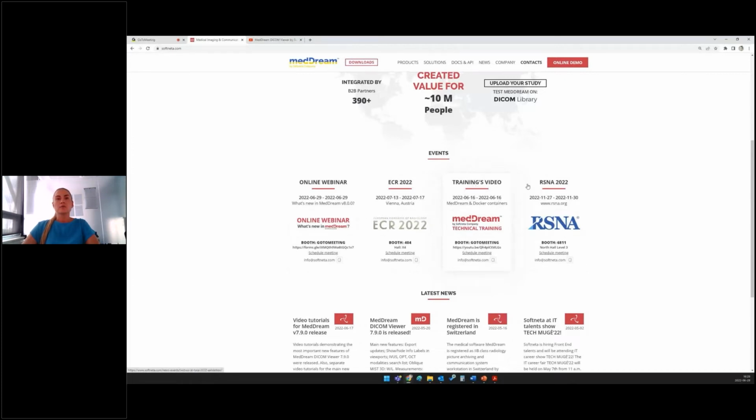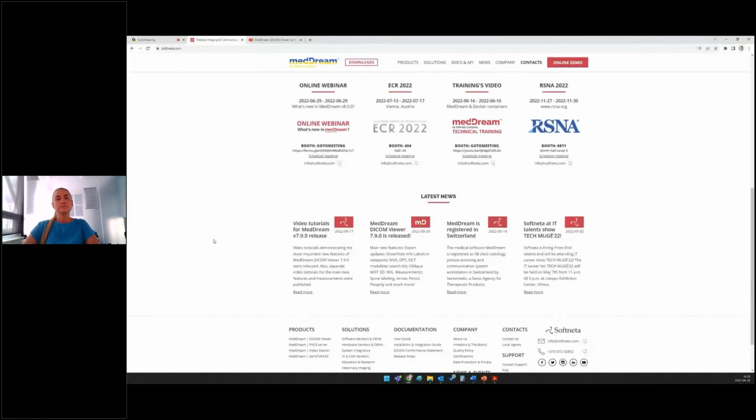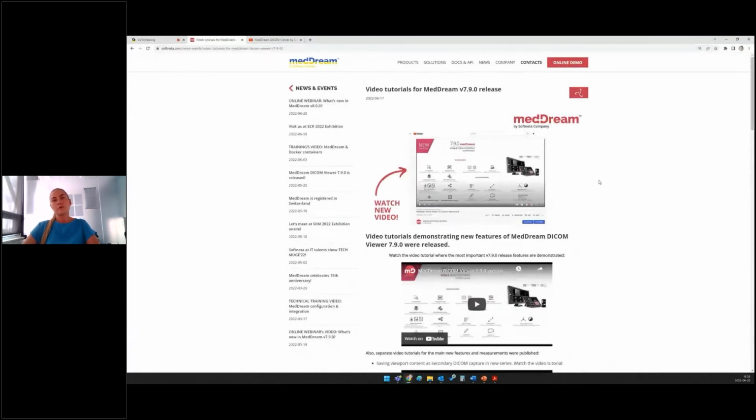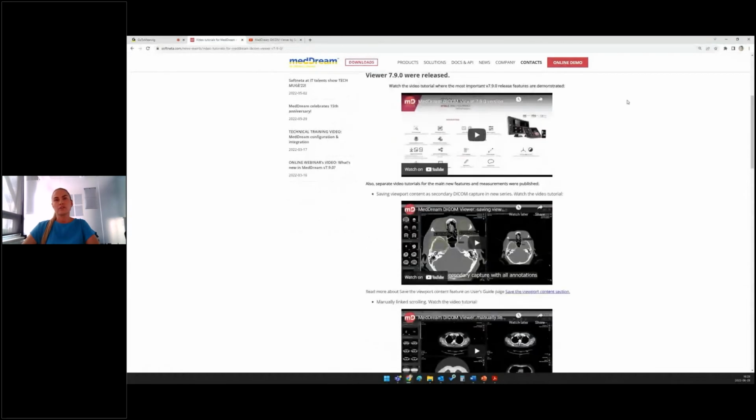And we have latest news. As I showed before, we have news that video tutorials for new releases and new features are prepared. So you can easily find all the new video tutorials in one page.